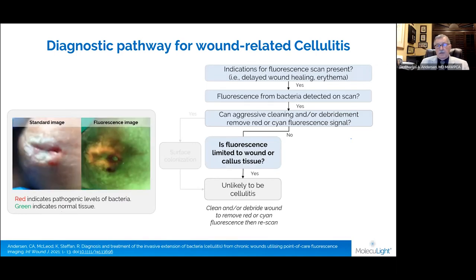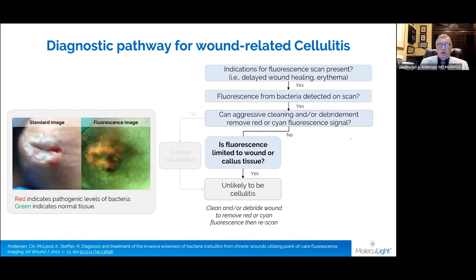This is a patient with a callus and a wound. The image shows fluorescence around that callus. So that's a callus we would debride, trying to remove as much of that fluorescence as possible, and then proceed with the treatment of that ulcer. This is not cellulitis.